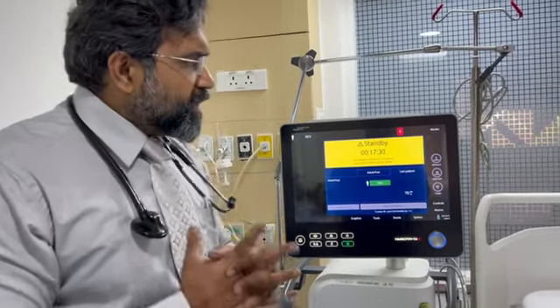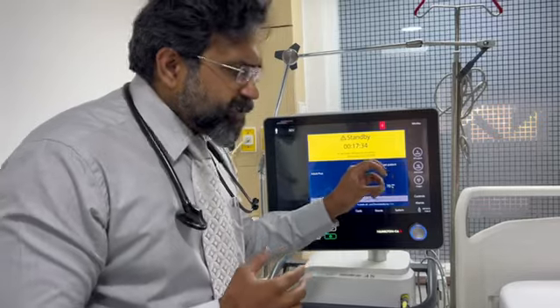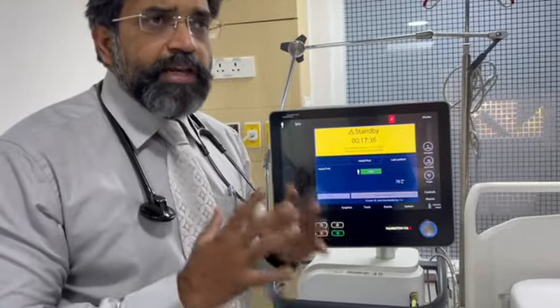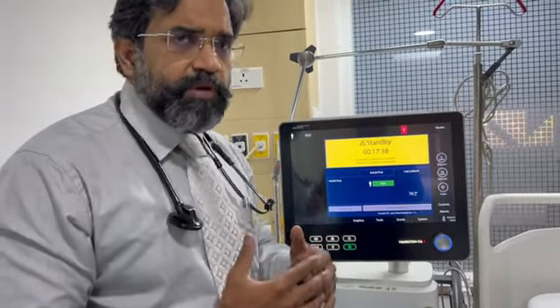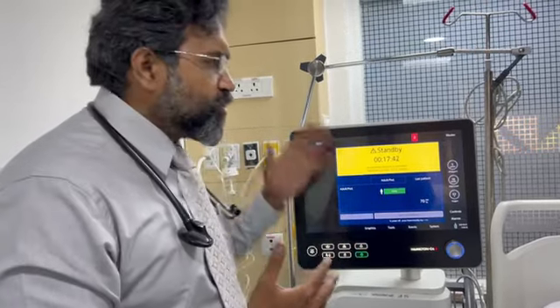Another thing that I want to emphasize is that whenever I am setting this patient on this ventilator, the tidal volumes that I must achieve have to be 1000 to 1500. This is the amount of tidal volume that I should see on my monitoring facility: 1000 to 1500 expiratory tidal volume. Also, the minute ventilation has to be at least 25 liters per minute. Why does the minute ventilation need to be 25 liters per minute? Because it needs to wash out the carbon dioxide.